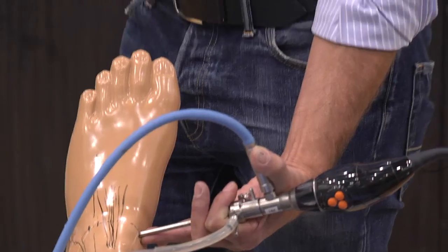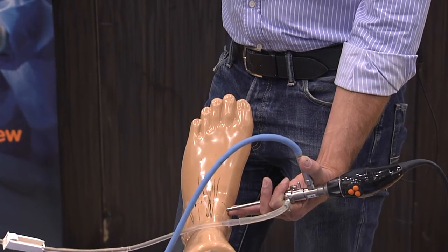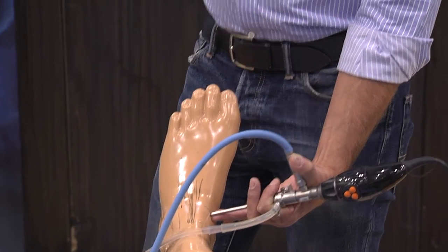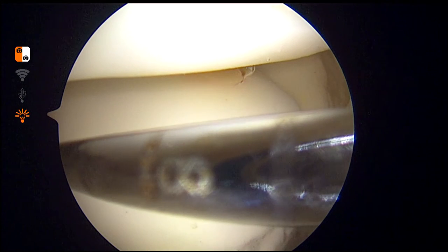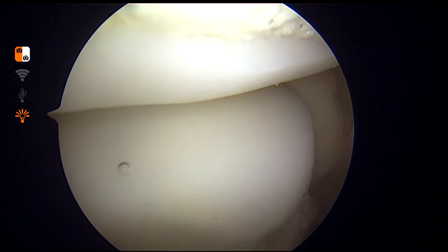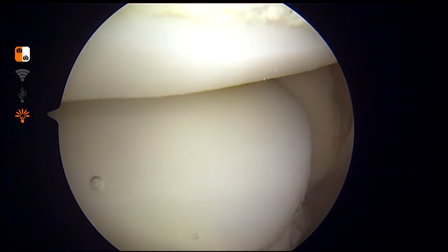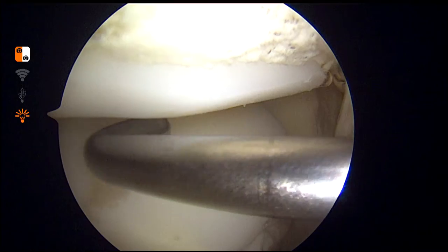What is interesting is how you introduce your probe, because you might get stuck in the soft tissue when you go in, especially on the lateral side. A little trick is to go in like this and wiggle it in — it finds its way into the joint. Bring it into the dorsiflexed position in which you made the portal and wiggle it in. If you go in like this, it makes it much easier to find its way into the portal.